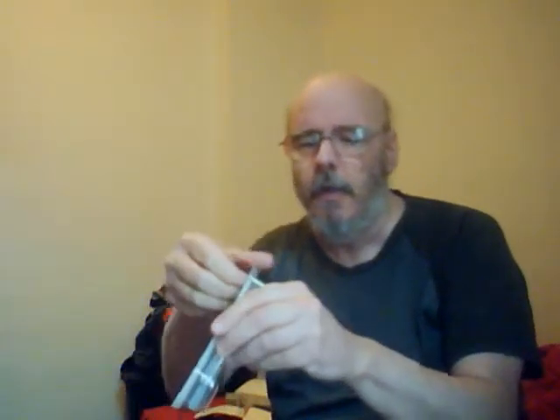I'm going to prepare myself for today's dose. Watch how easy it is to open up the contraption here. Just pull back the paper and reveal your syringe, which means that this is in no way, shape, or form, by any stretch of the imagination, child-proof. And so you have to be aware and cognizant of how you store your medication. If you have children in your house who could get into this, they should be severely instructed not to get into there, or you put it under lock and key. That's something that really needs to be stressed, because some kids like to play with this stuff and it can be dangerous. This is a blood thinner after all.